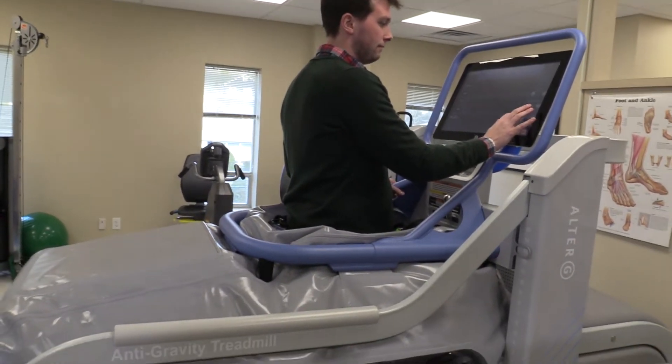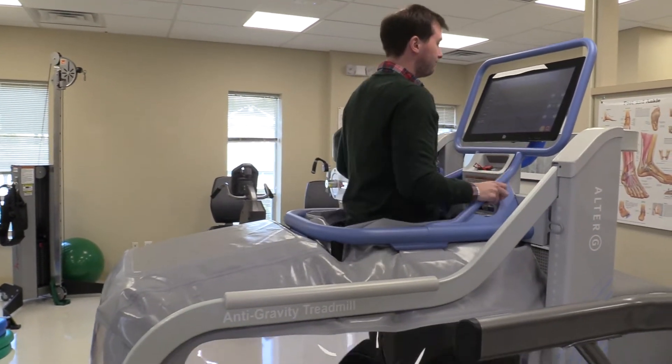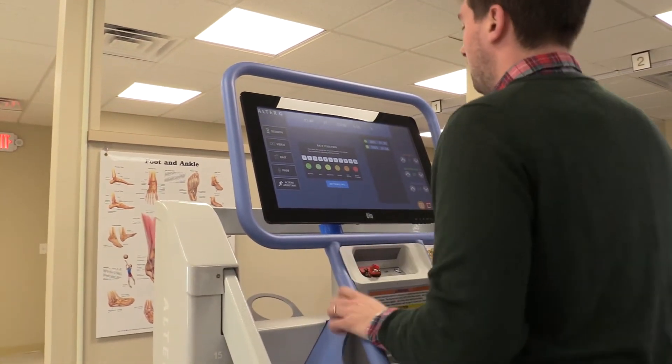A big population that utilizes this includes knee replacements, hip replacements, ACL surgeries, ankle sprains or ankle surgeries, or anyone who's been told they have to use crutches or a cane. We're able to use the anti-gravity treadmill to modify their weight and get them walking normally, so they don't develop weakness or gait abnormalities when returning to full weight bearing.